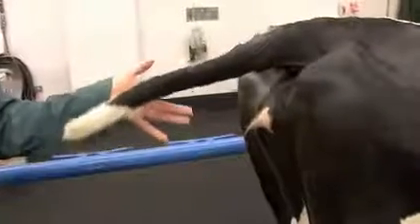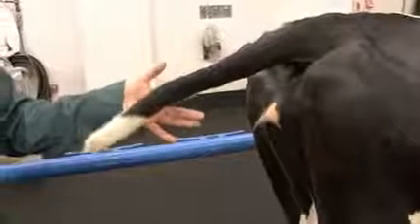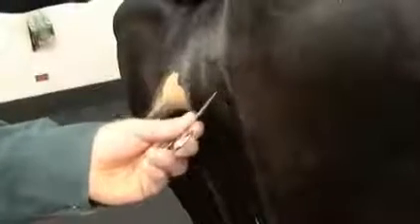When you are finished with the injection, remove the needle and syringe and allow approximately 3 minutes for the anesthesia to take effect. You can check the efficacy of your block by evaluating the tail tone of the patient. The tail should be flaccid and easily lifted. Pinching the skin around the vulva should also elicit no reaction from the patient following a successful epidural injection.